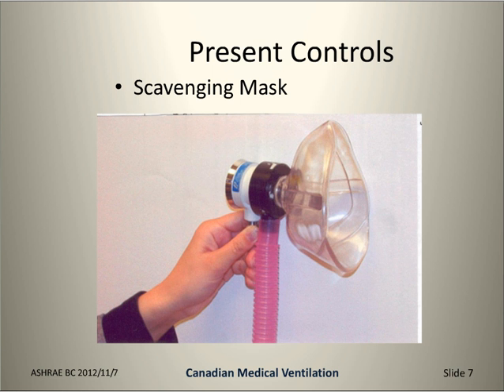There'd be no flow in that little pink exhaust hose unless the mask is sealed to the person's face and they're blowing to open up the valve. So that wasn't too great.